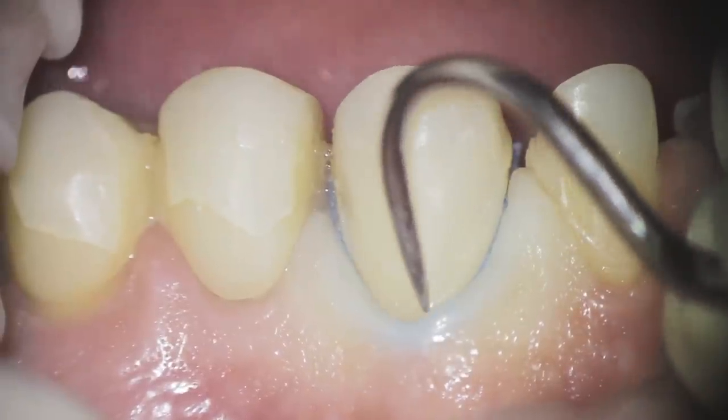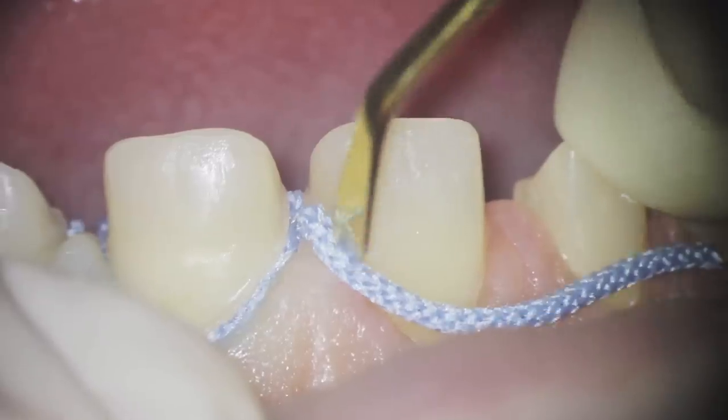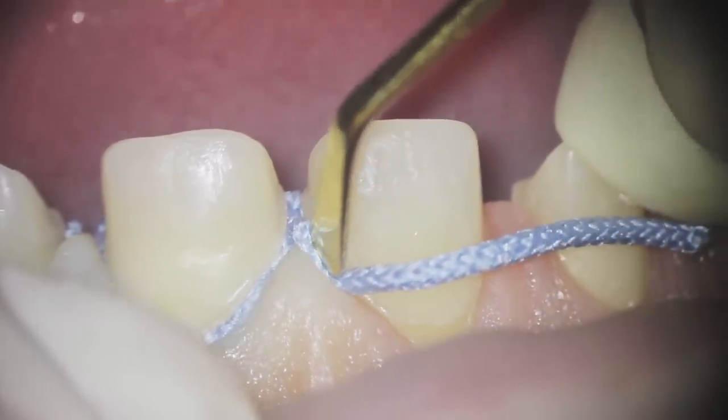It's absolutely important to understand what the retraction cord does: it creates a horizontal displacement of tissues. That means you don't have to press it too deep into the sulcus — it just needs to enter flush with the sulcus. It's very important to have a compact retraction cord because it will make the displacement easier.